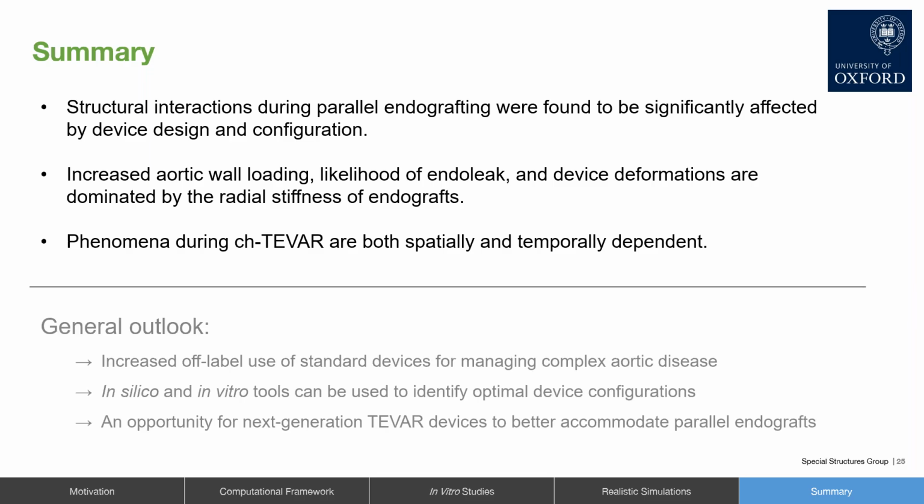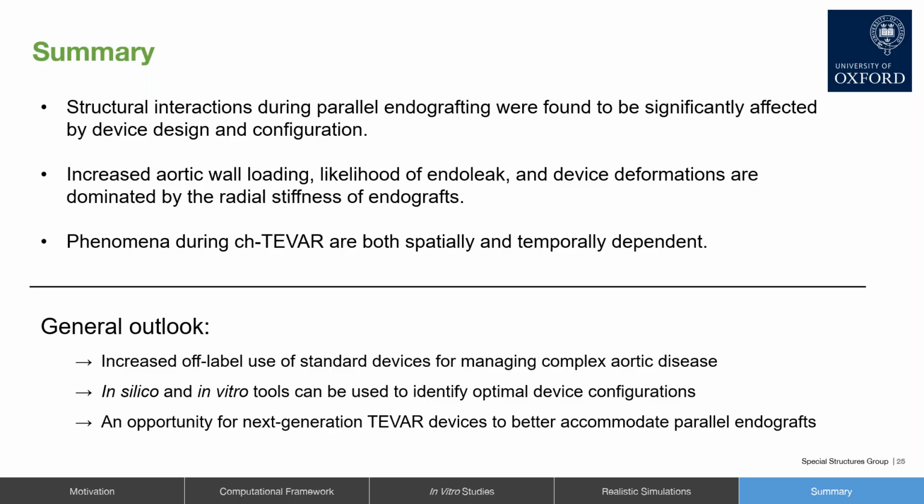Now, to close, a bit of a general outlook. What we're seeing now is an increased off-label use of standard devices for managing complex aortic disease. And what I had alluded to earlier in the talk is that devices are being used in a manner which is outside their instructions for use. And so what we can do is use these computational and experimental tools to really identify these optimal device configurations for which no consensus exists.